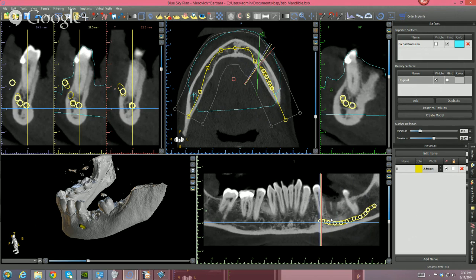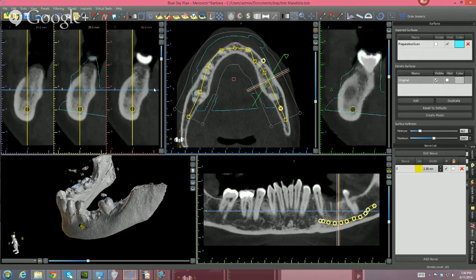But that doesn't mean that that's how close you should be, because there's something else about the mandible you should be aware of. It's not steel and it's not wood. It's like this spongy material, like you see over here. It's called cancellous bone. When you're drilling, first of all, your osteotomy burr is anywhere between 3/4 of a millimeter to a millimeter to a half a millimeter longer than the actual implant you're putting in. So if you're putting in an implant at 8 millimeters, for sure your drill is going to hit the nerve. That's number one. Number two, this bone is spongy, and there's blood inside.